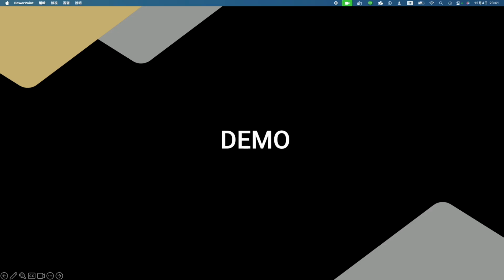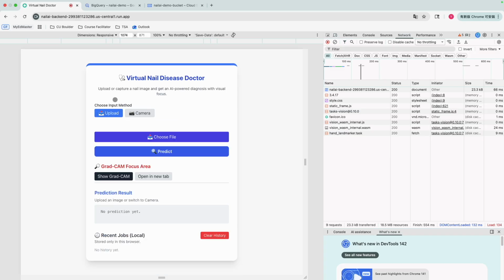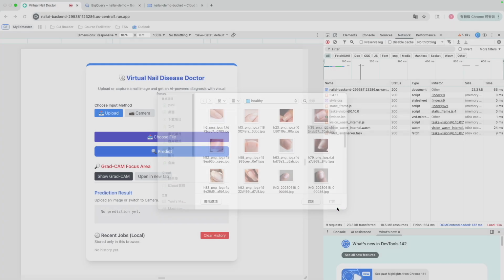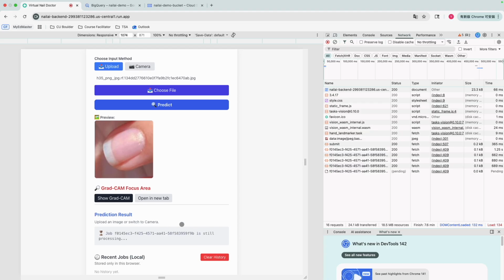Now I'll demonstrate the website. Okay, on the home page, I can choose to upload an image or switch to the camera tab. The camera version works on mobile as well and captures a cropped ROI of a single nail. Here, I'll upload a sample image. Okay, then let me choose one image. And when I click predict, the image is uploaded, stored in Cloud Storage, and then queued as a Pub/Sub job. Then the UI shows me a job ID and starts polling for progress.